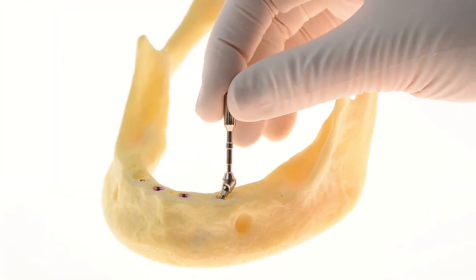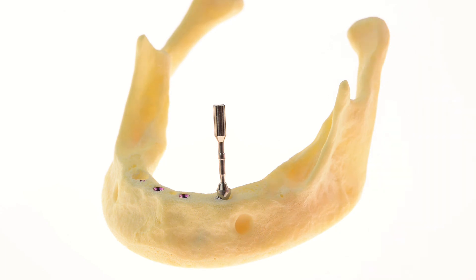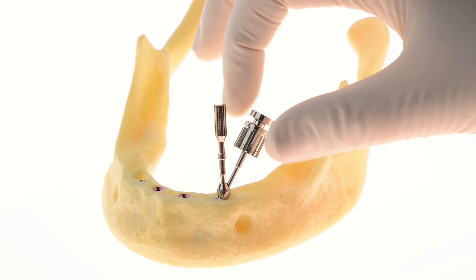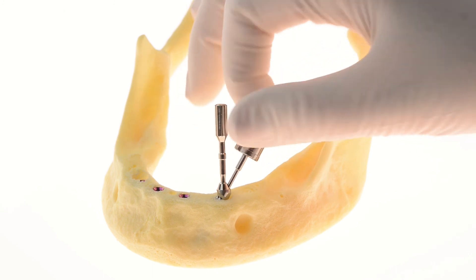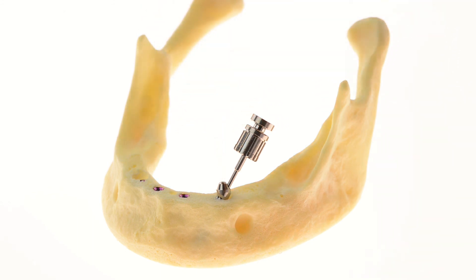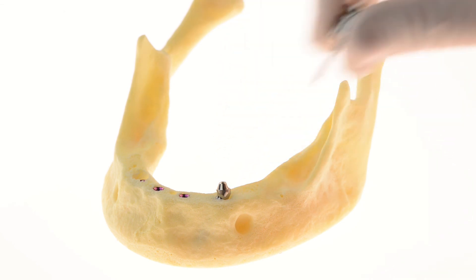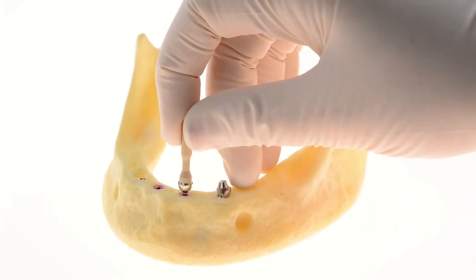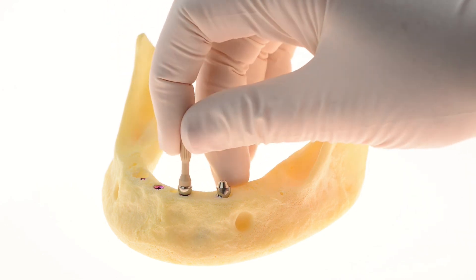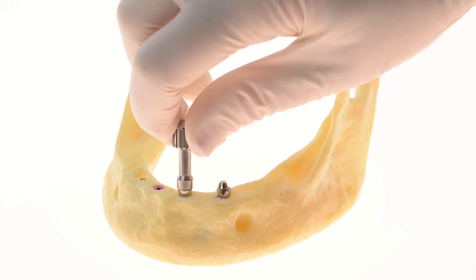Next, connect the multi-unit abutments to the implants for optimal distribution of force. Use the prosthetic screwdriver to tighten the solid, angulated abutments. All MIS multi-unit abutments are delivered sterile with a gripper to ensure safe assembly. Use the multi-unit key to tighten the straight abutments.